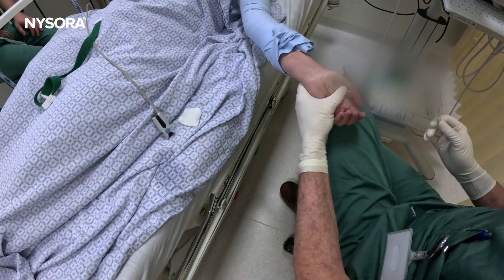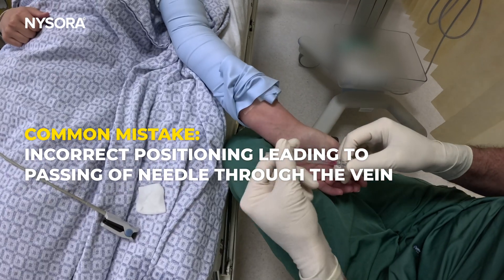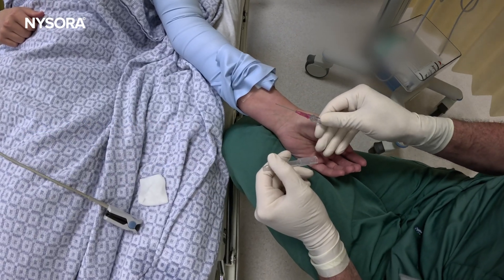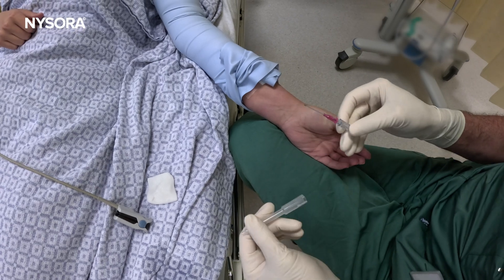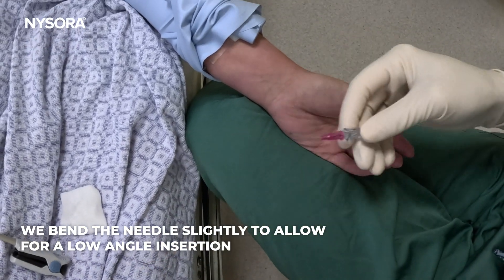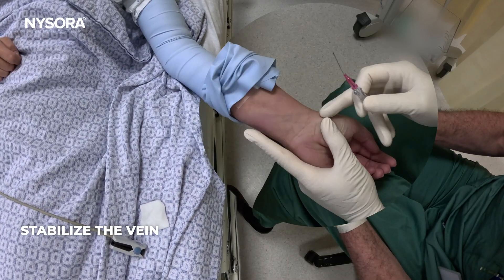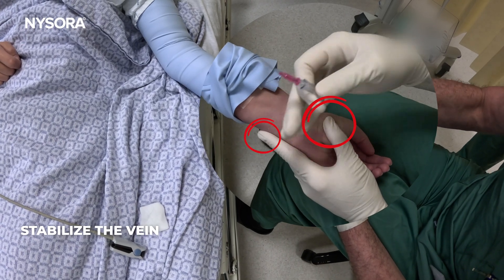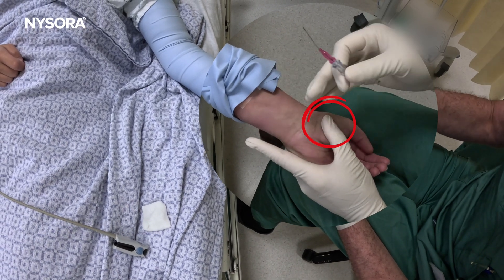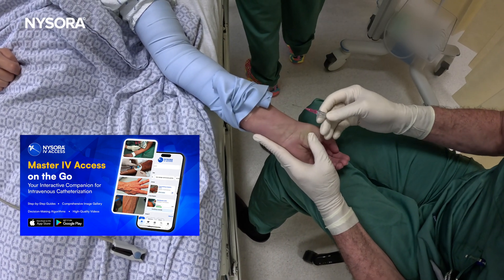One of the most common mistakes I've seen nurses do is that they assume a position where you cannot go superficially enough to place the catheter in the vein, and it just goes through the vein. So I oftentimes bend it like this, which allows me to get in and lift it up as necessary. Two-point stabilization here, and a little tapping to cause vasodilation and inflammatory response, which helps the veins pop up.